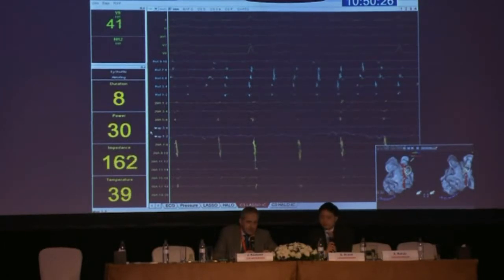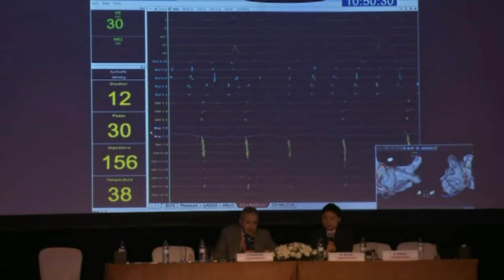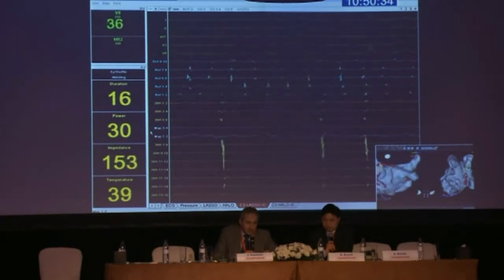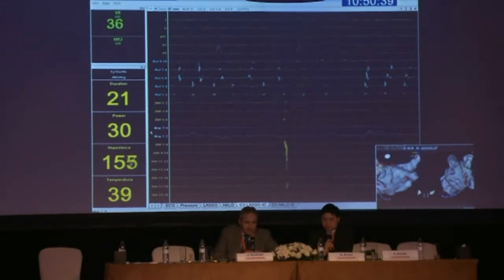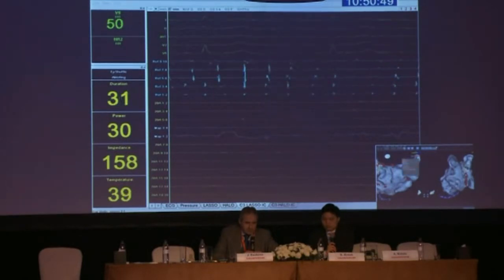That's exactly what happened here, Andre. So you can see that the FAM we created with the PV is bigger. And what I've done is I've added regions that you can't see to draw in the isolation. Isolated. Yeah. I've added lesions to draw the FAM in to where the geometry truly is. Yeah. So you can't see the lesions because I'm using them just to pull in the FAM. Yeah. I could show you them.